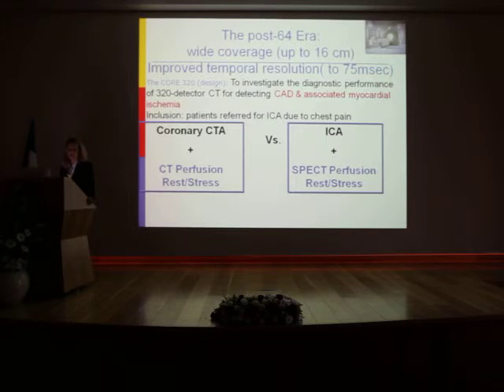And it's designed to investigate the diagnostic performance of 320 detector rows for detecting coronary artery disease and associated myocardial ischemia. So what they are going to do is compare the combination of coronary CT angiography with CT perfusion at rest and stress, all non-invasive assessment in one study, versus invasive coronary angiography plus SPECT perfusion in rest and stress.